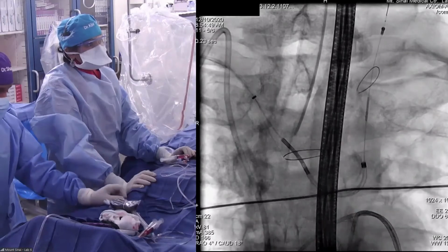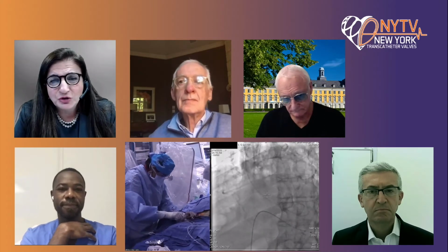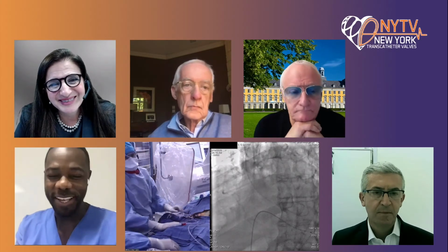And now, Roxana, you can have our discussion with our extreme panelists. Well, thank you so much. So a really great case of a bicuspid valve. I want to hear from Didier Tchétché, especially given the choice of the valve, and here the Sapien is chosen. Is there a valve that should be chosen, one versus the other? And then we'll come back to Alex and Eberhard about neuroprotection and also some of these parameters. Didier, welcome.